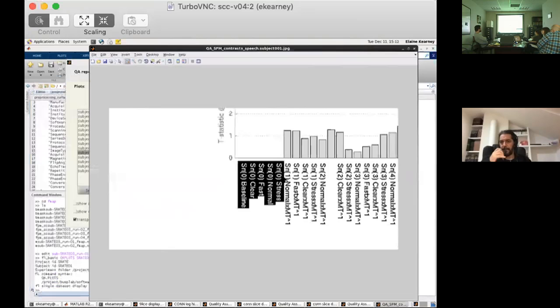So why are there different columns for different sessions? Like, why is there a session 1 normal by MT and a session 2 normal by MT? Right, because those are the interaction effects. I don't know if I have an option to allow you to specify whether you want those interactions to also be session specific or not. But you can actually specify which contrasts you want. I think by default, when you specify the session invariant effect, it's going to use anything that you mention in your contrast definitions. Those are going to be the effects that are modeled as session invariant.